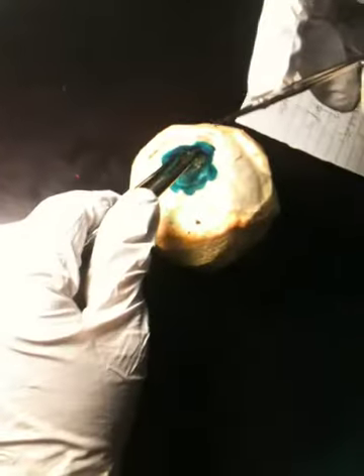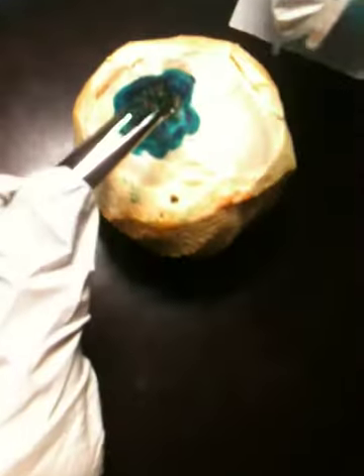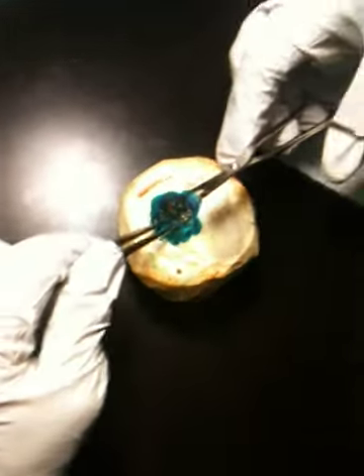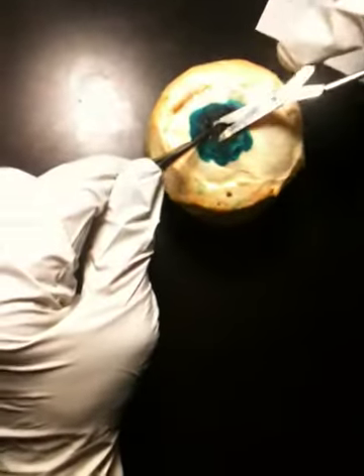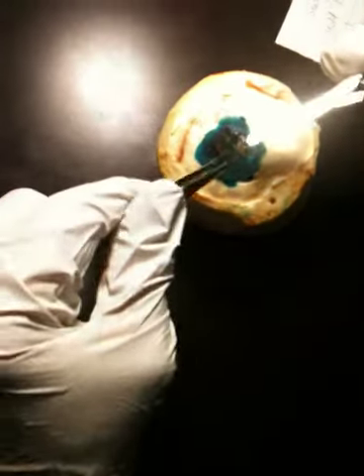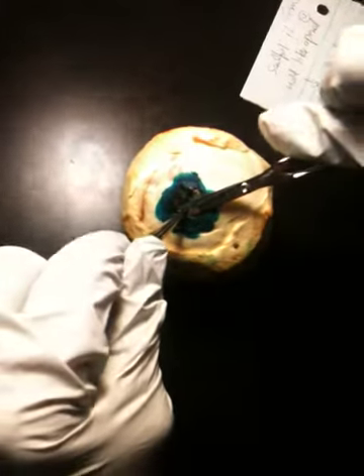So what you're going to do is make sure that the position of the scissors is facing upwards, and you're going to lift off the tissue with the forceps and make gentle cuts.